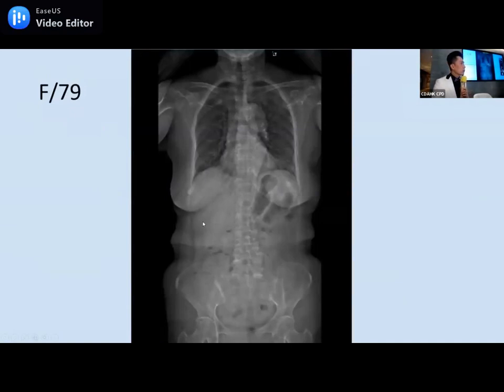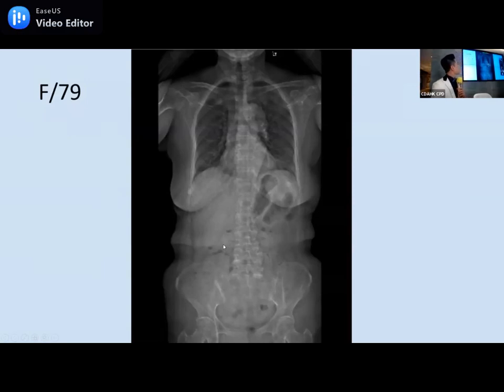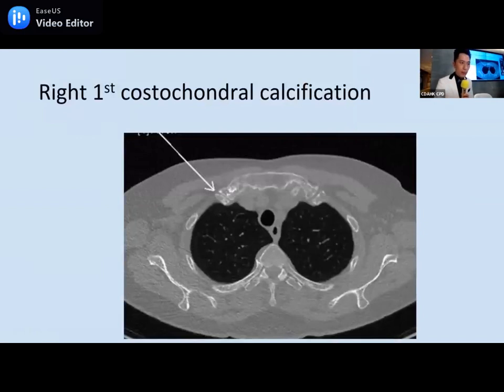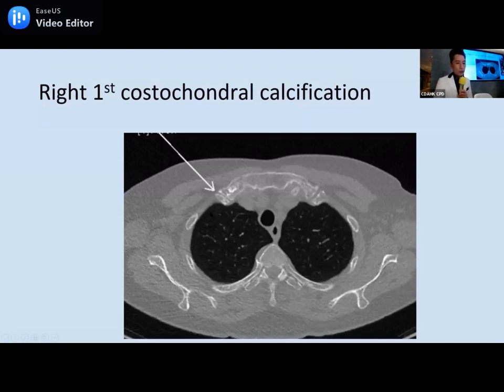This case also yields a post-spine AP view. Looking outside the spine, there's something in the right side. On CT, we see calcification of the right costochondral junction — this is a benign finding. However, we should do a CT to confirm, as it could otherwise appear to be a lung nodule. For this benign finding, no follow-up will be required.